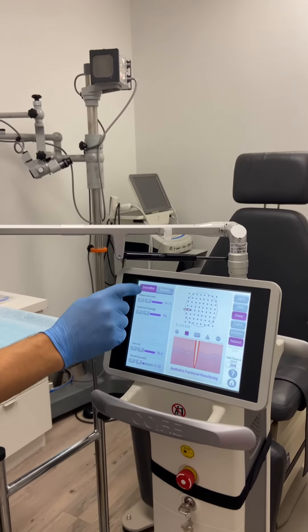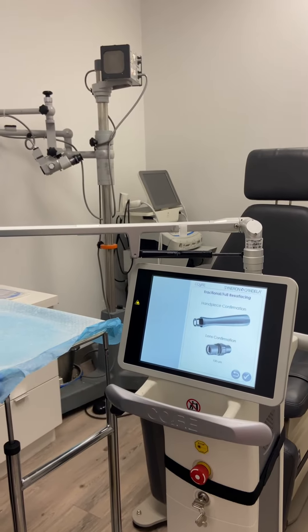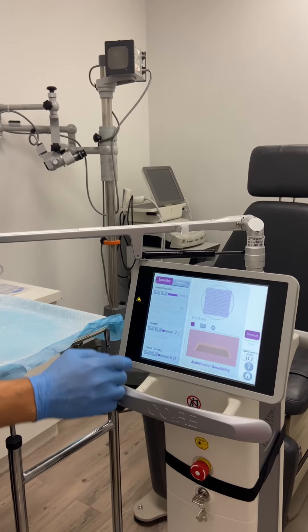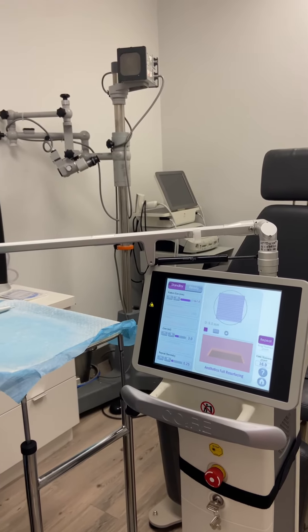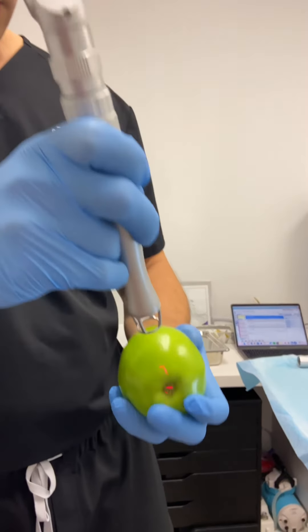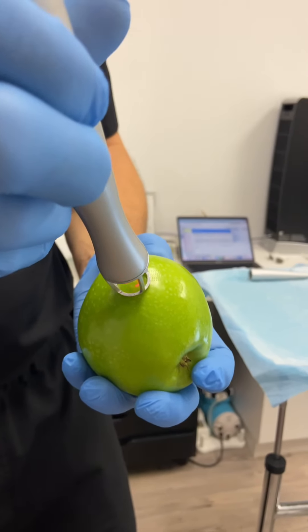For extreme acne scarring, we'll often go to classic mode, which is not fractionated but full ablation. You can change the size — we'll go to a square, keep it consistent. I usually do serial passes on 1 to 3 millijoules. Depending on the skin type, the higher the energy, the more heat, so if we want to avoid pigment issues, we stay low heat. That was mid mode at 40%; I'm going to go right below it on classic mode.